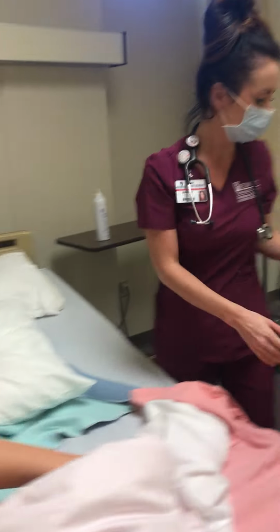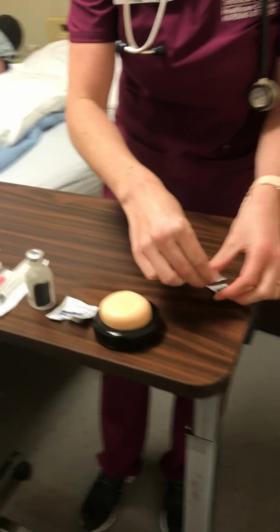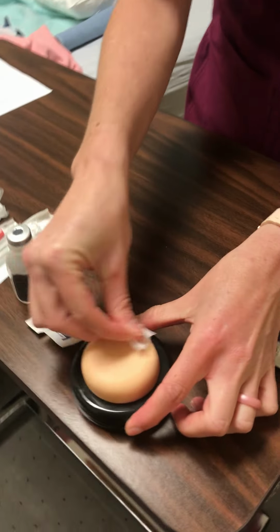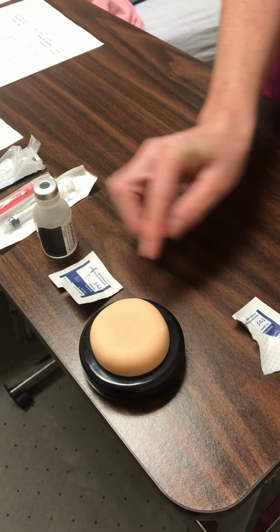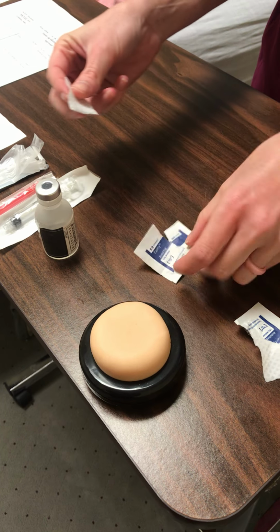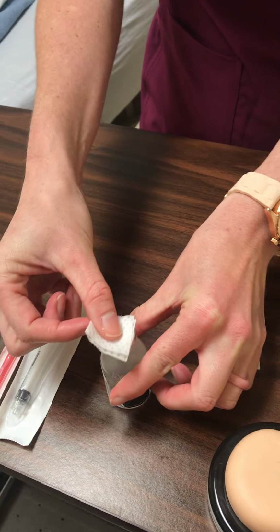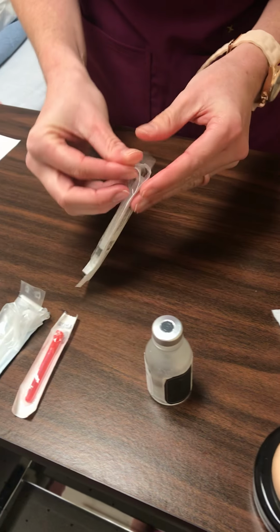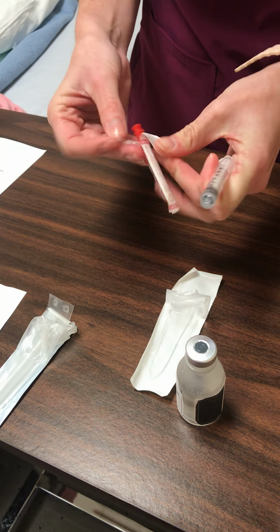Okay, so now that I have him ready and in position, I'm going to go ahead and clean my site. So I would clean my site for 30 seconds and I would let that dry. I would also clean my vial, as it is a multi-dose vial. Let that dry. I'm going to grab my 3 ml syringe and my blunt tip needle.